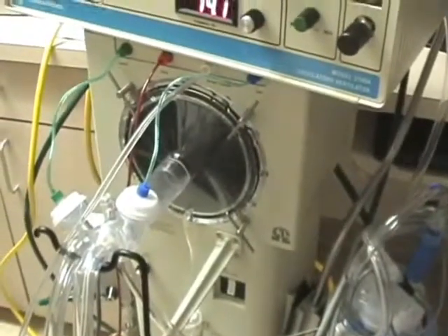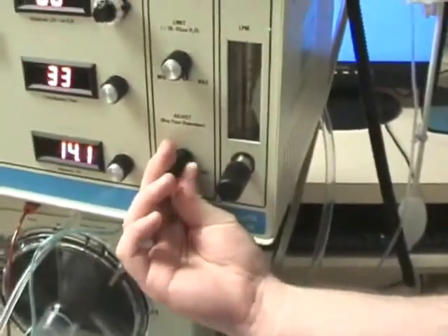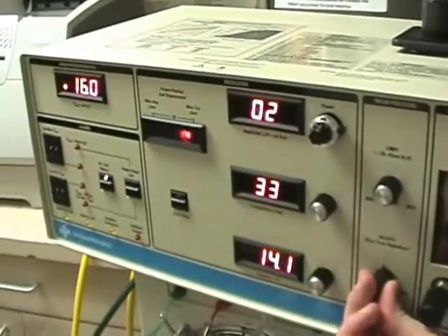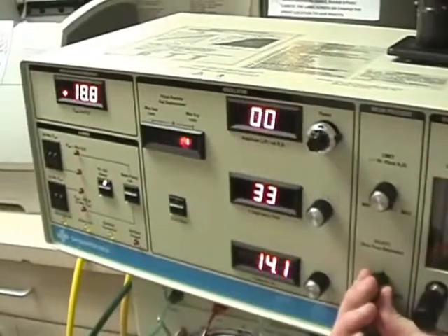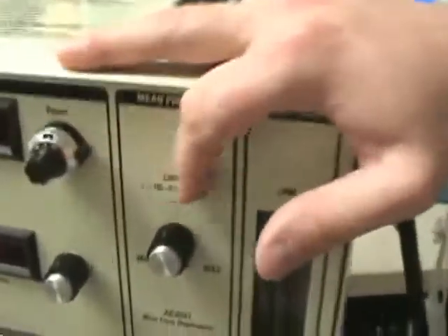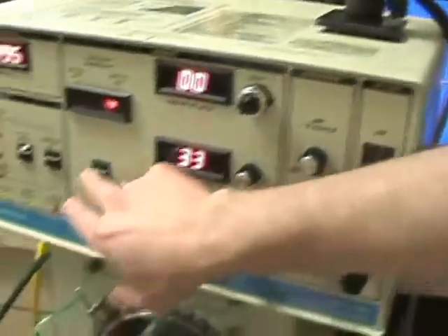Okay, and now to start it. Now you want to turn this so that we get a pressure of 19 to 21. Okay. And this needs to be at 6. Okay. Is it? You can barely see it, 6. Yeah. Okay. And then you can start oscillating.